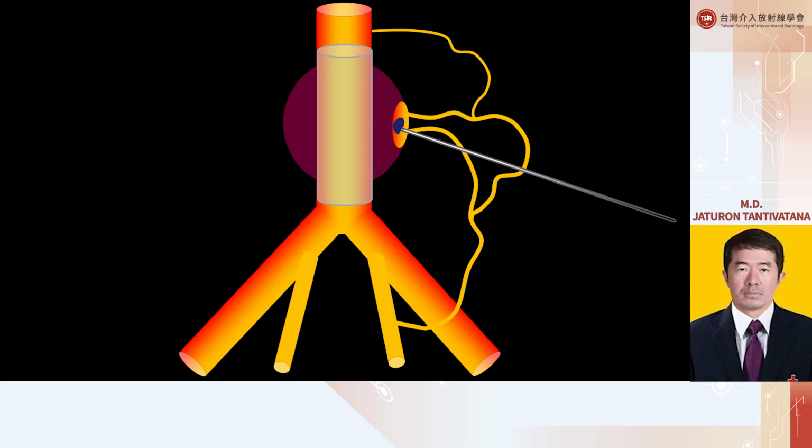Another approach is bypassing all of these hassles of catheterization by using a percutaneous approach with ultrasound or CT guidance to get directly into the residual sac of the aneurysm and then inject the Onyx. One of the advantages is that we can always remove the needle without sticking because of the properties of the Onyx and the metals right here. But we still have to prime the needle with DMSO and keep injecting, with the same principle, until we get into another branch, filling the cavity.